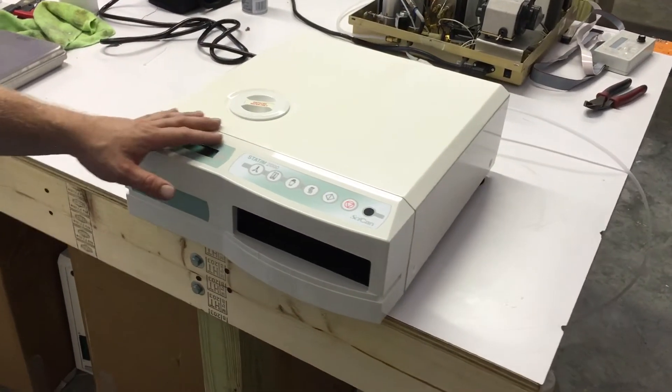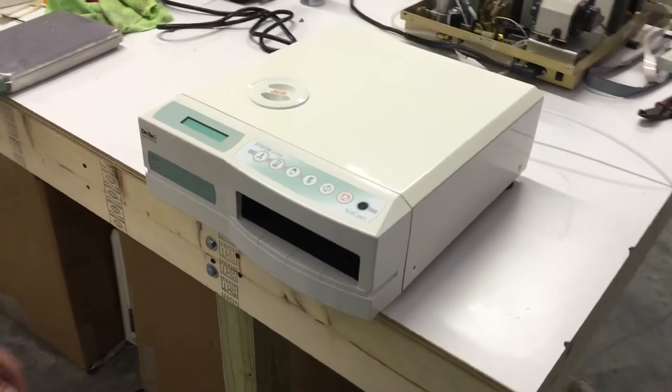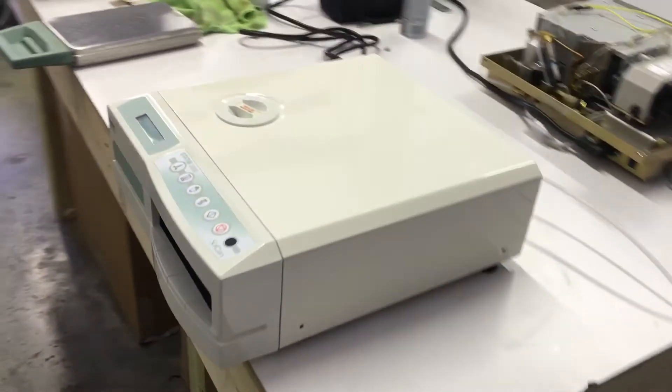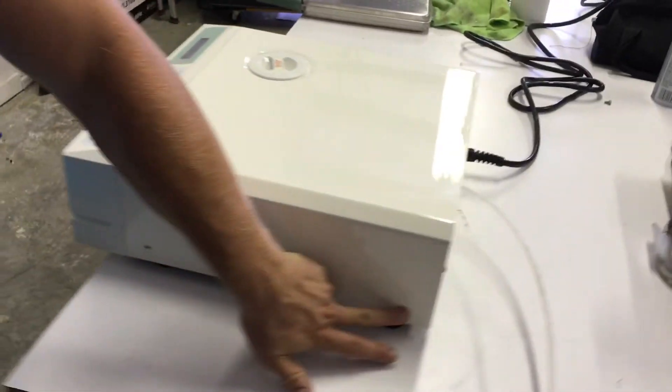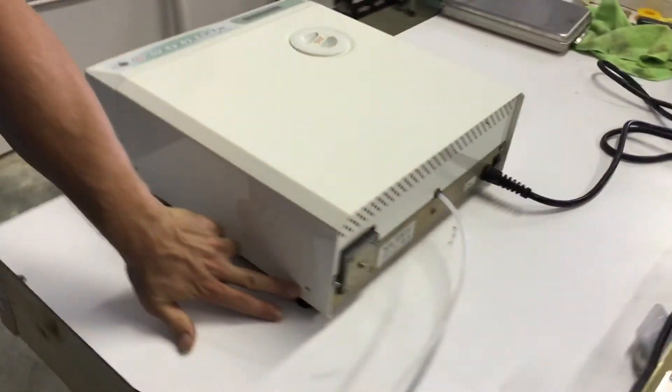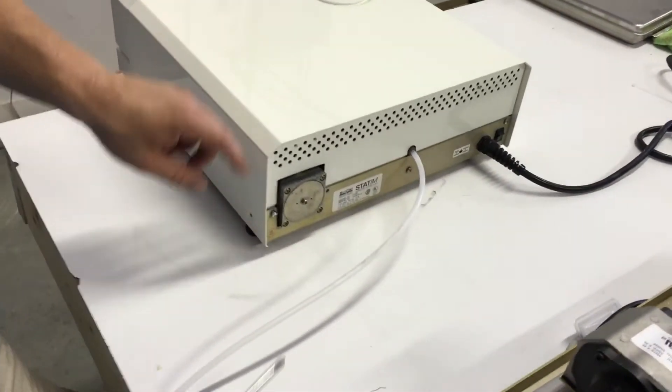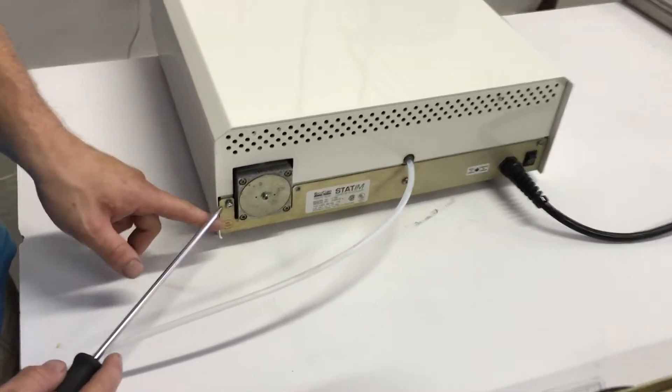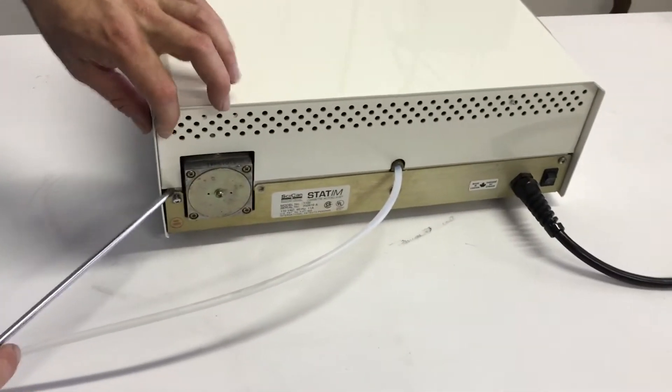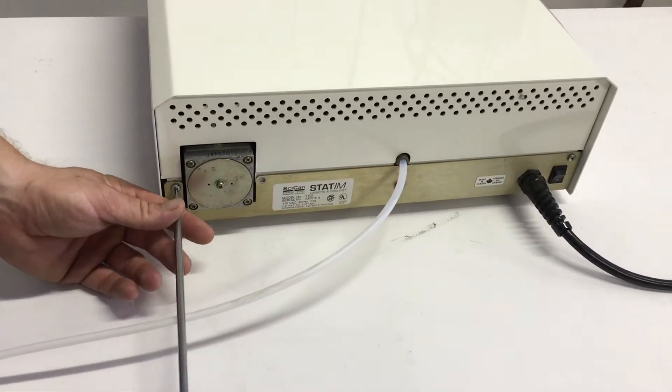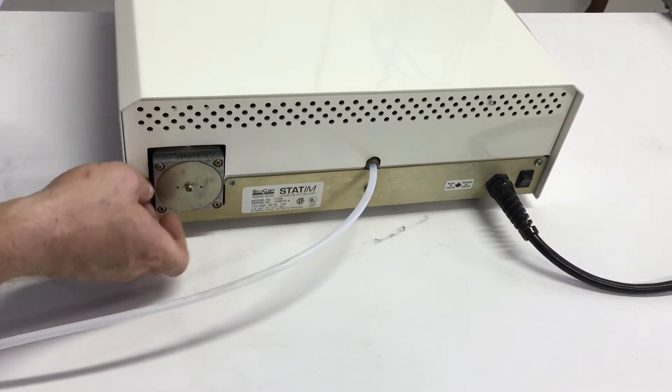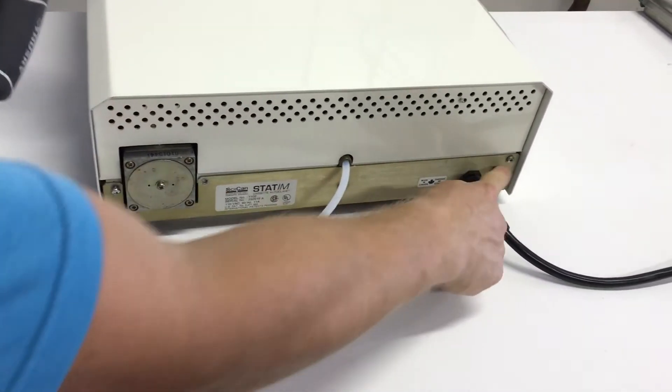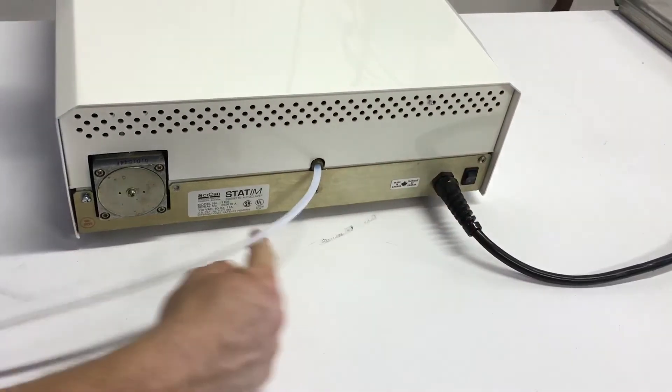There are seven screws that we're going to have to unscrew. There's two on either side, left and right, and then three along the back. There's one here that I already got partially unscrewed, one here, one here.